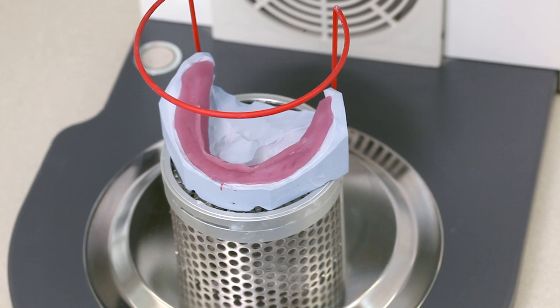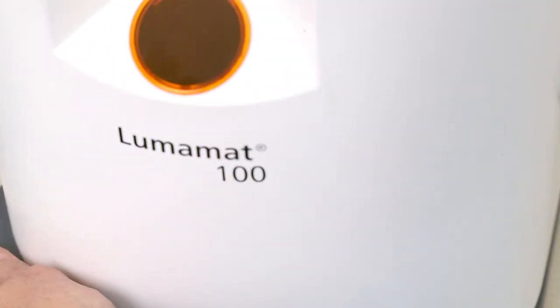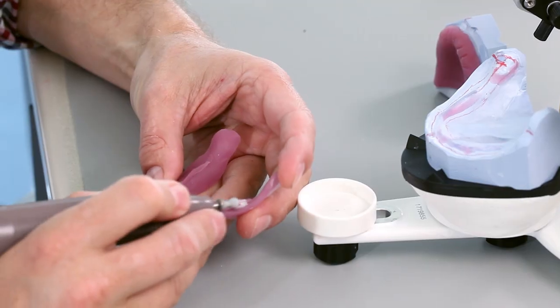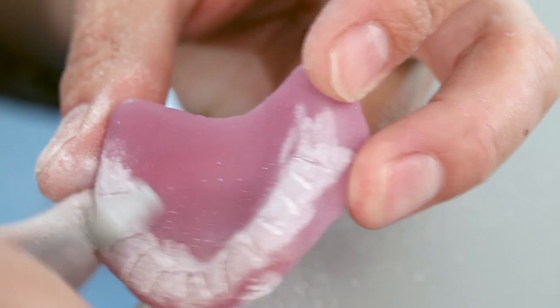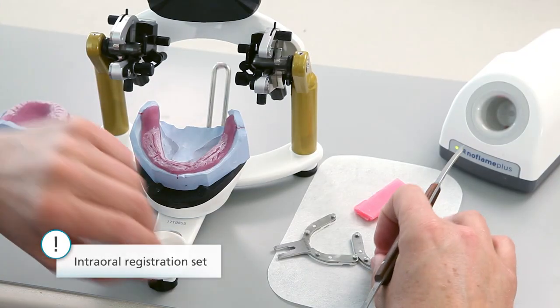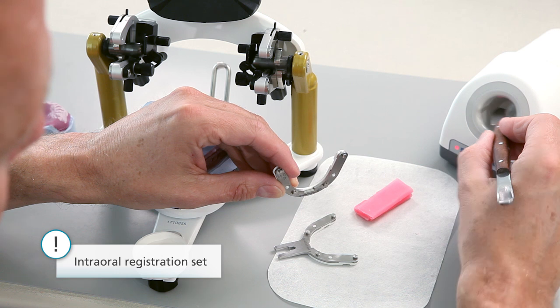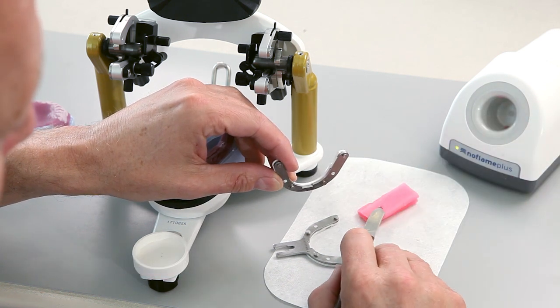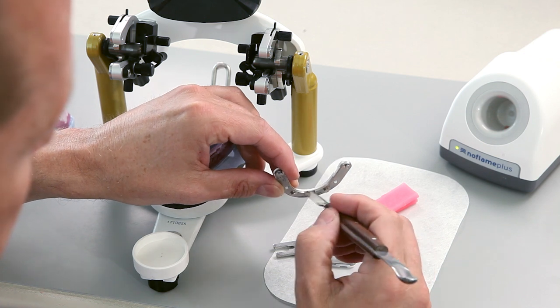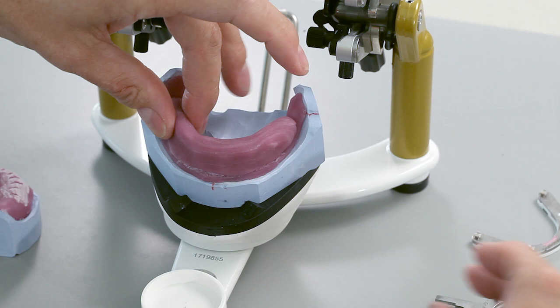Light curing is carried out according to the manufacturer's instructions. Roughen the surface and remove interfering surplus. Intraoral registration is particularly suitable for determining the maxillomandibular relationship in an edentulous patient. Protect the retention elements of gnathometer M with wax. Use tray material to build up the lower rim.